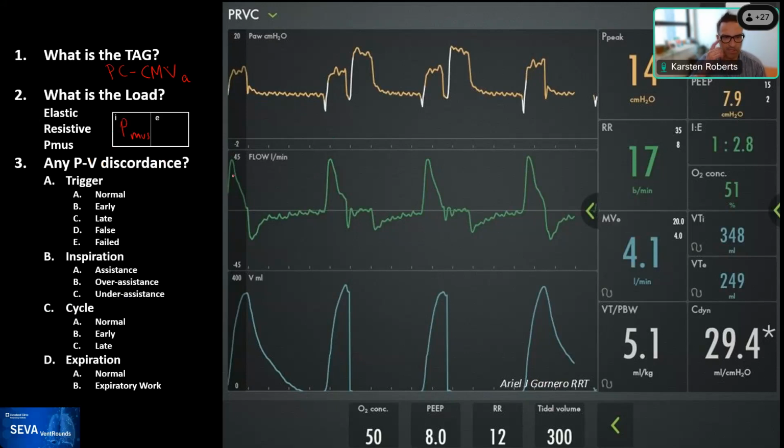And we can see that because this ventilator's waveform actually shows us where the patient is making an effort, and then we can also see, as Eduardo is drawing on the flow waveform, that we don't see the exponential decay as we would expect in each of the 4 breaths that are on the ventilator. So that's where we can tell for sure that the patient is making an effort through the inspiratory phase of the breath. And then what about the expiratory phase?